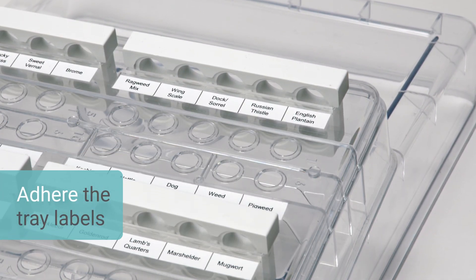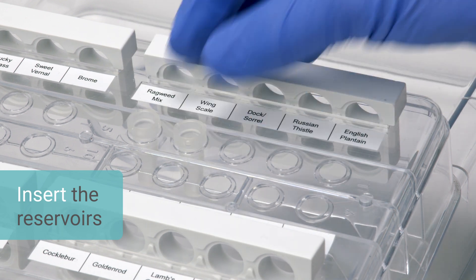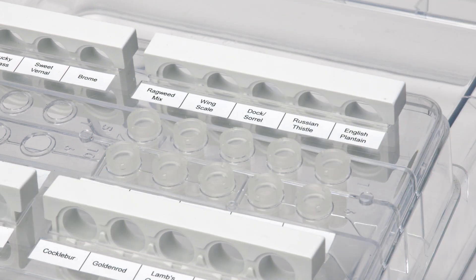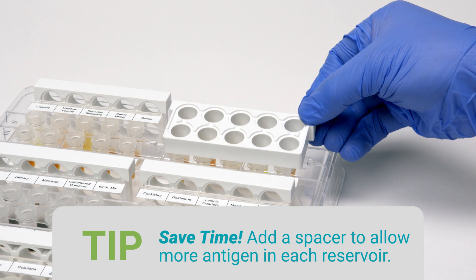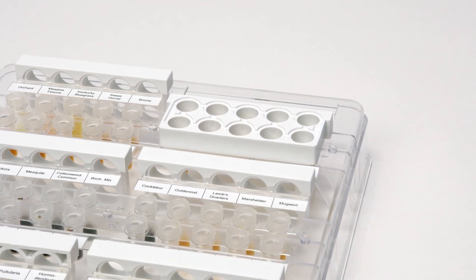Ensure tray labels are adhered. Snap a reservoir into each hole of the tray. If desired, secure the spacers over the reservoirs. Store any unused spacers in the slots provided on the tray.